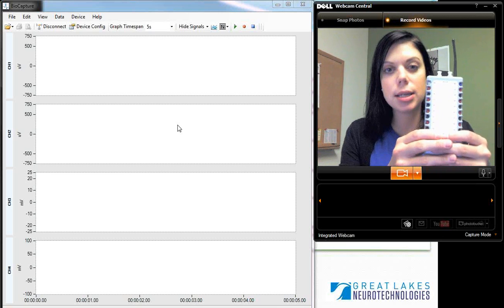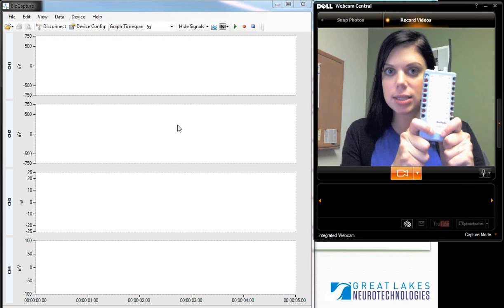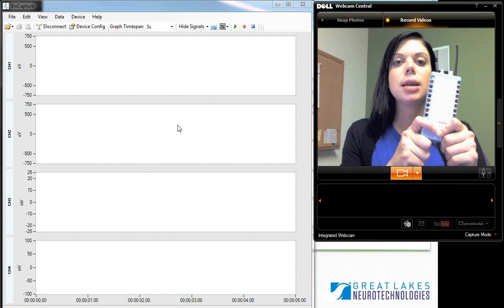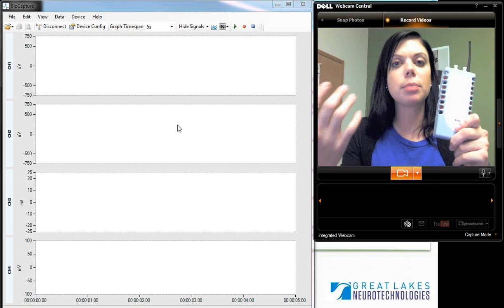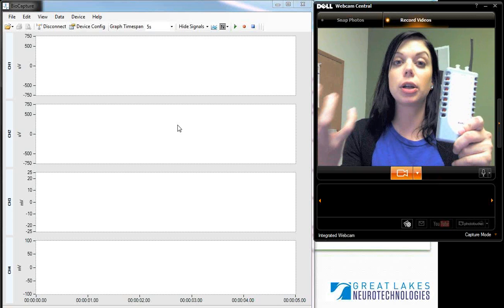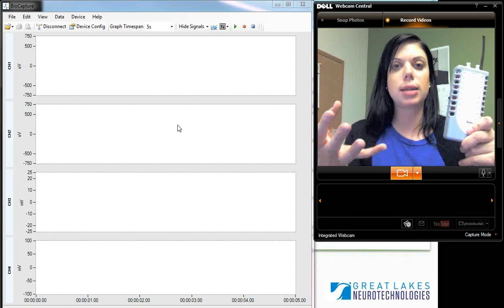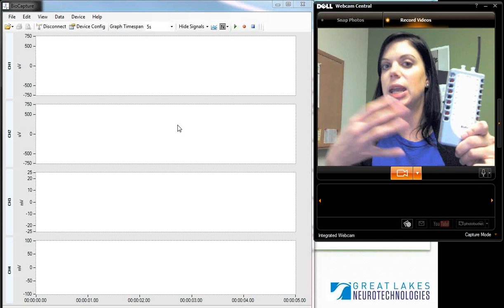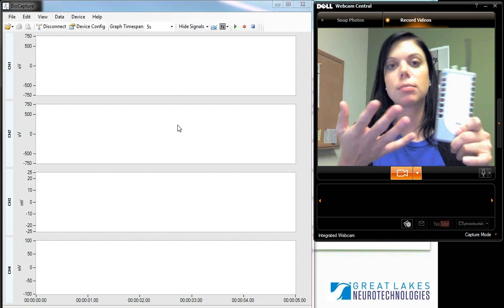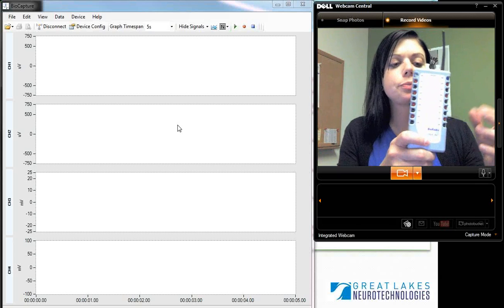As I mentioned, EEG is a very, very small amplitude signal, and so built into the device are amplifiers that crank up the gain on those signals in order to make them visible and viewable, so that you're getting very useful information while you're collecting your EEG data, and it's something that can be analyzed and used per your particular application.